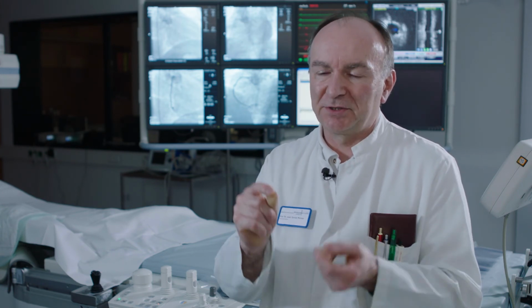For intravascular imaging, you have the option of OCT, of course, and there's no doubt that the resolution of OCT is superior to IVUS. But the downside is, in a CTO environment, you want to see the adventitia. You need to see the outer border of the vessel. And you need to also analyze, especially when we do antegrade wiring procedures, you need to move your IVUS forward, backward. So your imaging catheter, you need live. OCT gives you a wonderful pullback, and it might be helpful if you put absorbs at the end. But during the procedure, you need live.